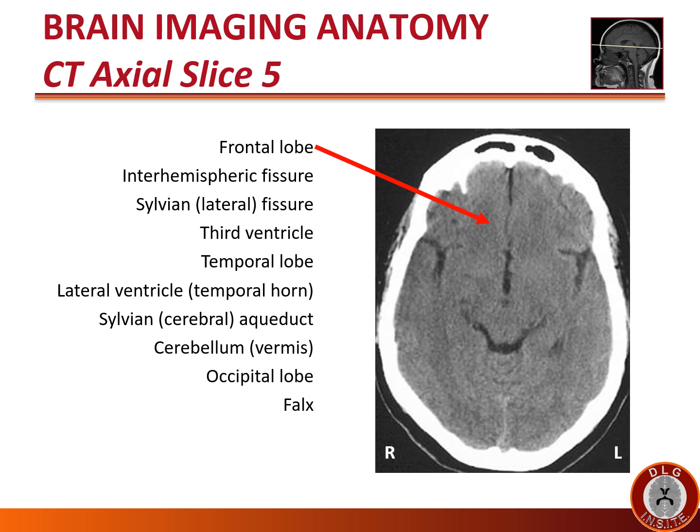Ventrally we continue to see the frontal lobe. In between the frontal lobes, we see the interhemispheric fissure, where the anterior cerebral arteries run. At this level, the sylvian or lateral fissure has a different appearance — it looks more like a T, separating the temporal operculum from the insula and frontal lobe. At this level you might see small round middle cerebral artery branches within the sylvian fissure.